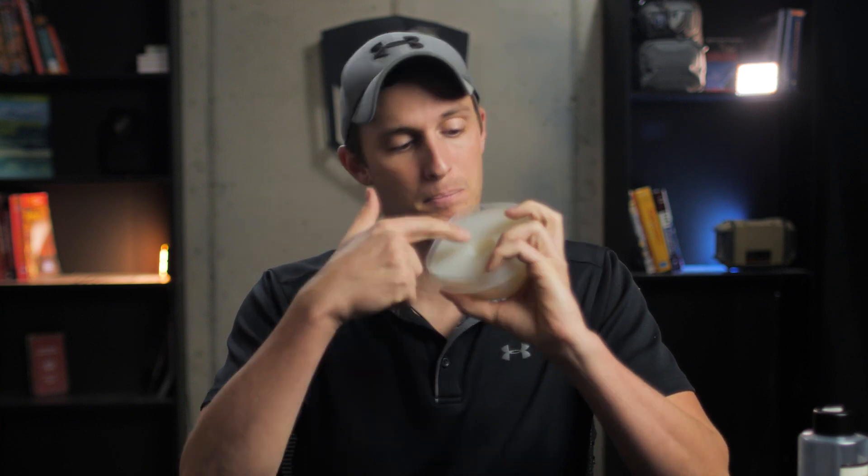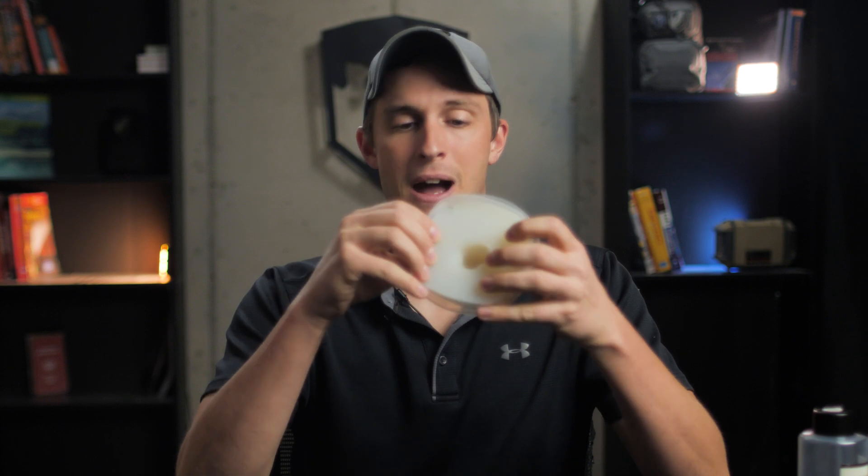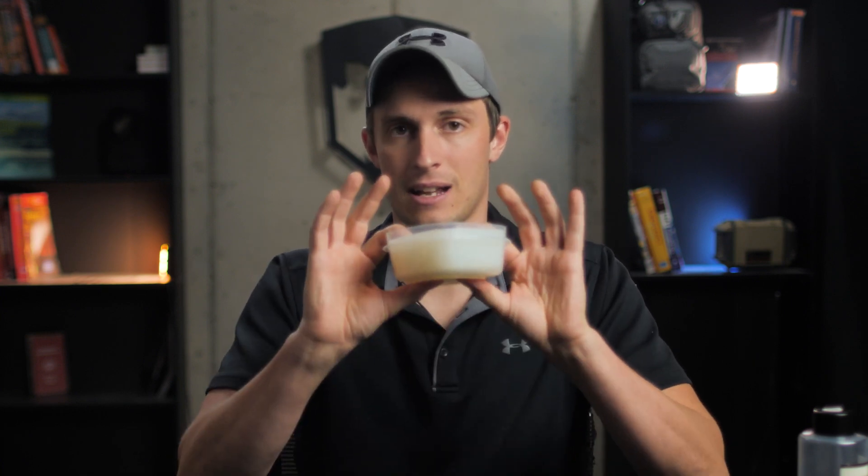A couple of extra things you can add: if you want, you can run IV tubing or some sort of tubing down to the bottom before you pour the silicone. That allows you to push blood or simulated liquid down inside the prop during training. You would want to do that before pouring. If you do that, you might want to leave some space on top to coil that tubing up, snap a lid on it so any blood or liquid stays inside — nice and clean.